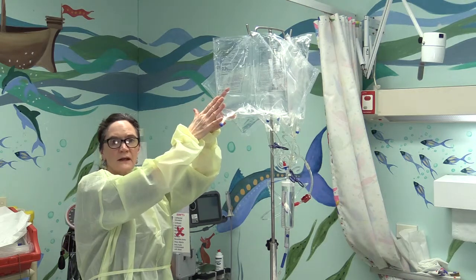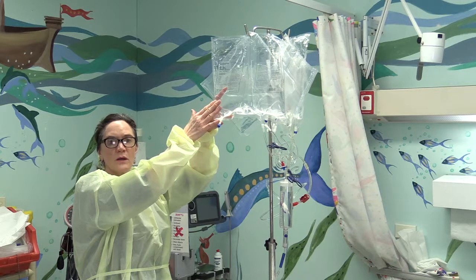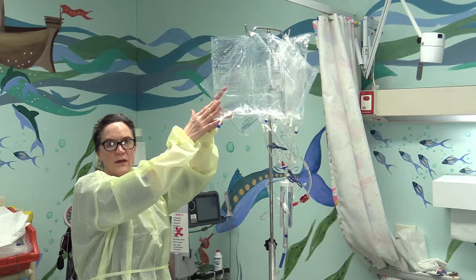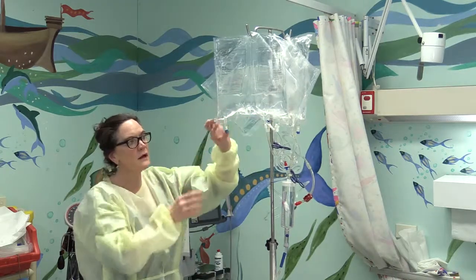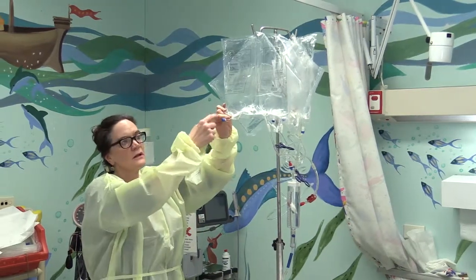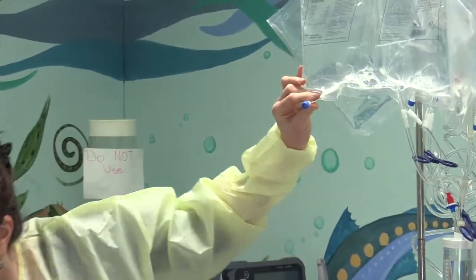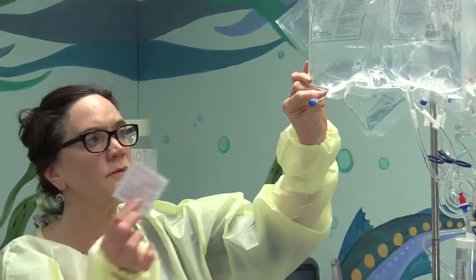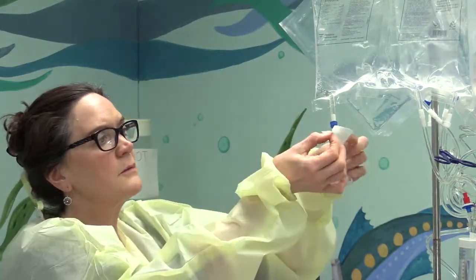They're 2 litre bags, so it will be 2 mils of lignocaine and 1 mil of heparin, 1,000 units per mil, into each bag. Before adding it, you would wrap the injection port with an alcohol wipe, like so. It would be wrapped around before adding the medication.